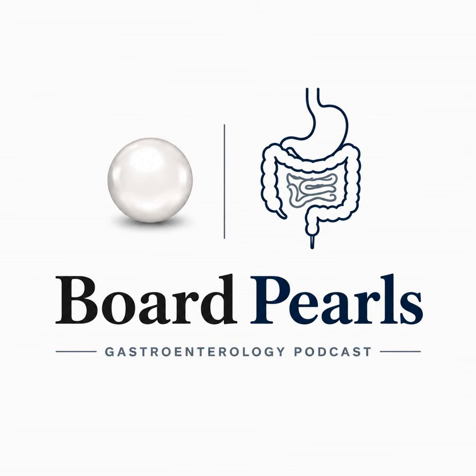That trade only holds if the lesion is actually resectable through the scope, which means no intraductal extension and no invasive cancer. So before you resect, you image with EUS or intraductal ultrasound. The question EUS answers is whether the adenoma has crept up inside the bile duct or pancreatic duct beyond the papillary orifice. This matters because the snare can only grab what sits at the surface. It cannot reach tissue that has tracked up into a duct.